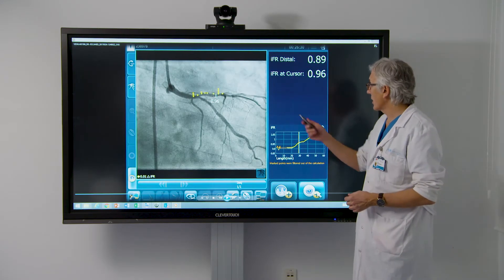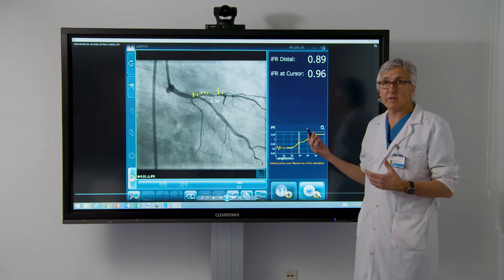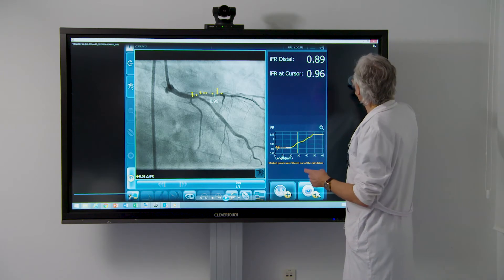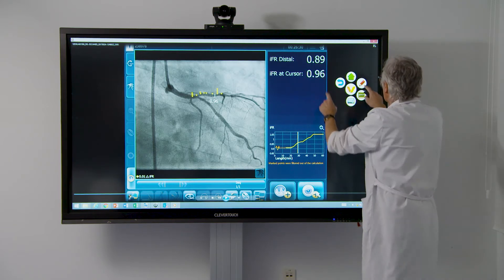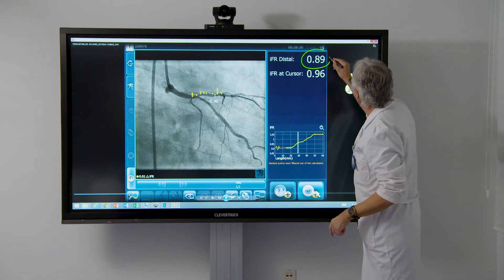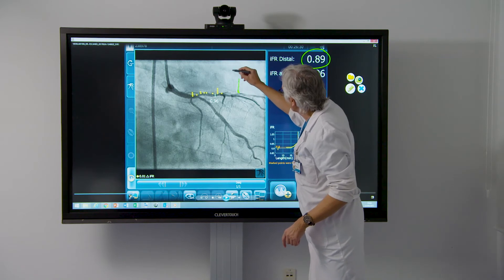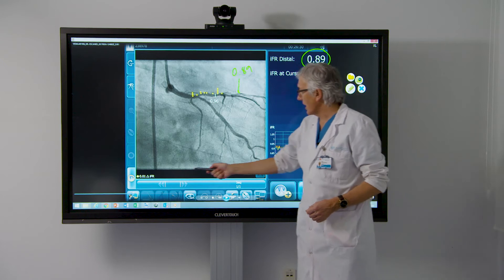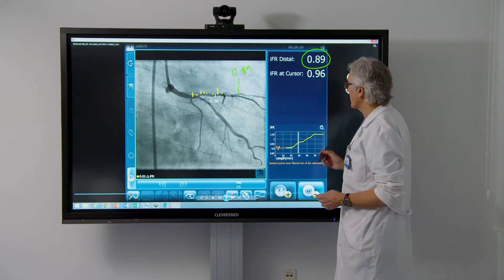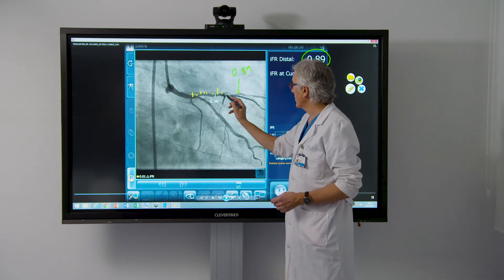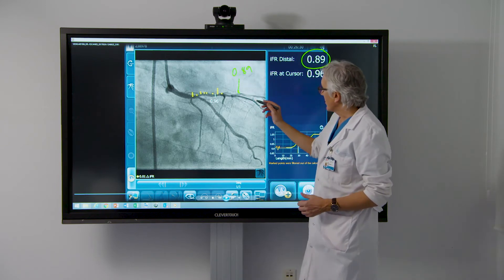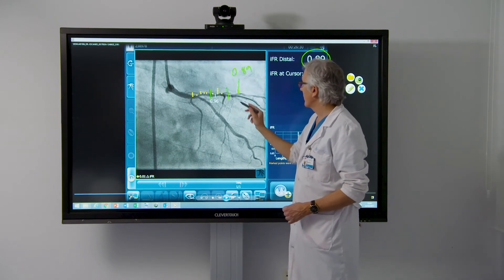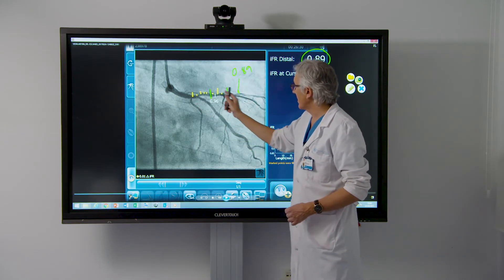IFR co-registration with angiography gives us the answer. In the distal part of this vessel we have an IFR value of 0.89, which is very abnormal. Each dot accounts for a drop in IFR of 0.01 units, showing us that treating up to this location would improve hemodynamics. However, in this diffusely diseased vessel we need to find adequate landing zones to remove as much hemodynamic impairment as possible — a question that physiology alone cannot answer. We now need imaging.